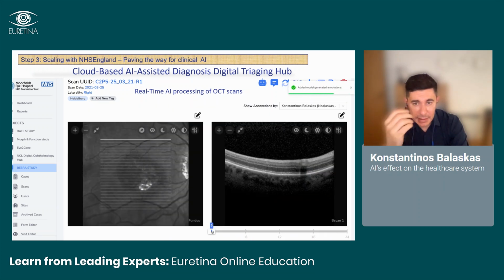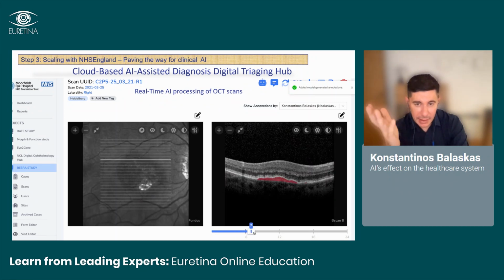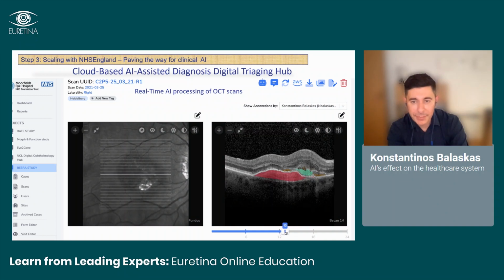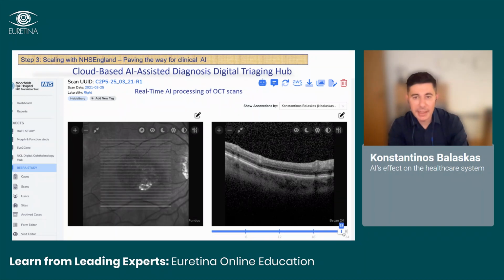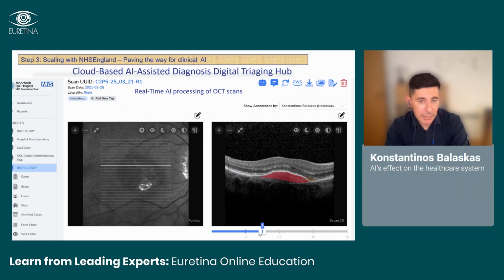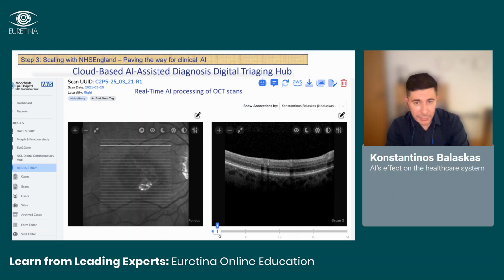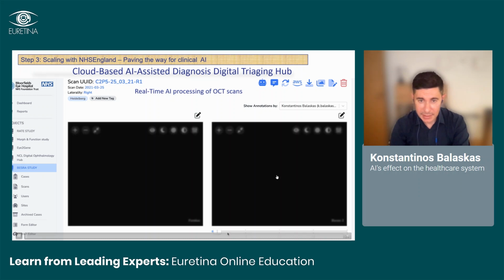And now it has run the segmentation, it has produced the segmentation overlays, and it has projected them on the OCT in real time, highlighting the areas of PED, subretinal fluid, subretinal hyperreflective material, and intraretinal fluid, which can be an assisting technology for example, community optometrists that don't have the skills to interpret the OCTs, but also for our better understanding of the natural history of the disease, the response to treatment. That pertains to wet AMD, to neovascular AMD in this instance.